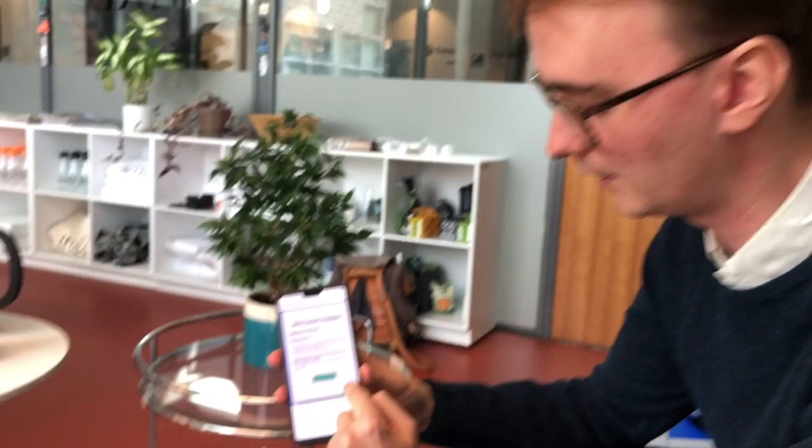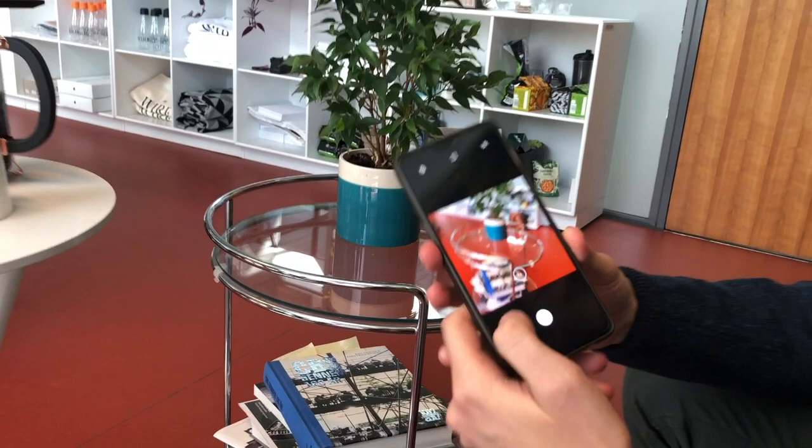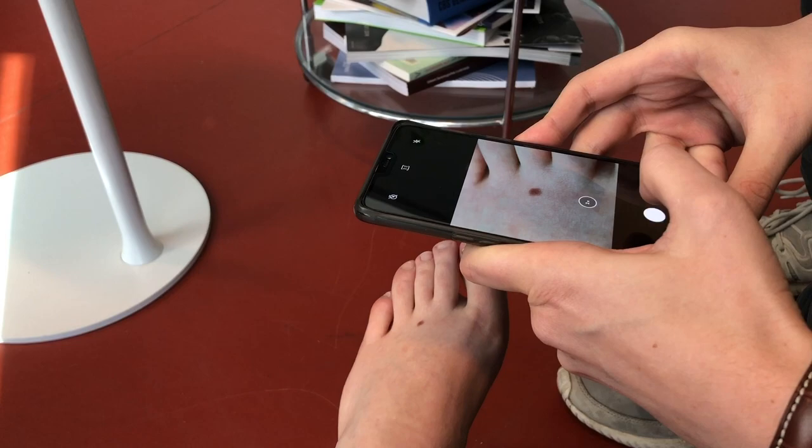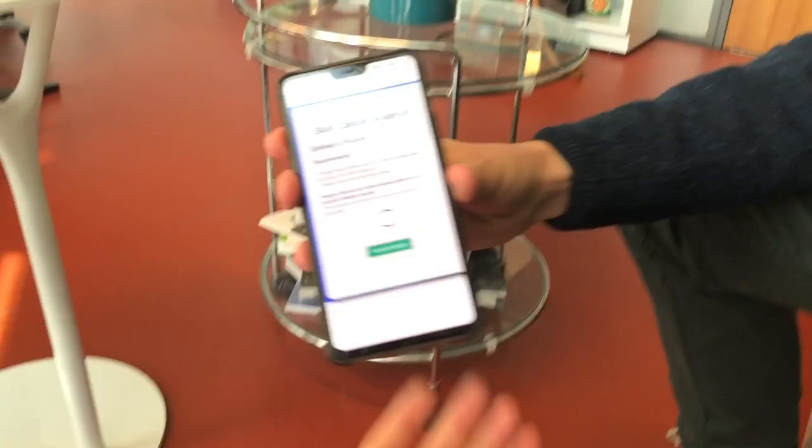You start by clicking 'Upload and Analyze' and then you're prompted to go to your camera. You access the camera, choose the skin lesion, snap a picture, and click OK.